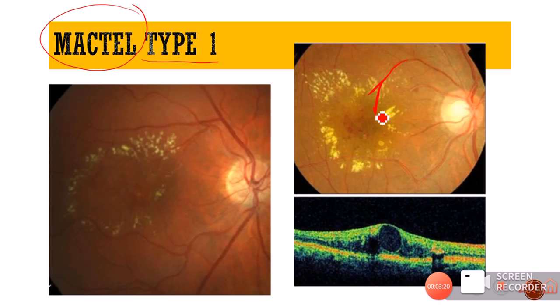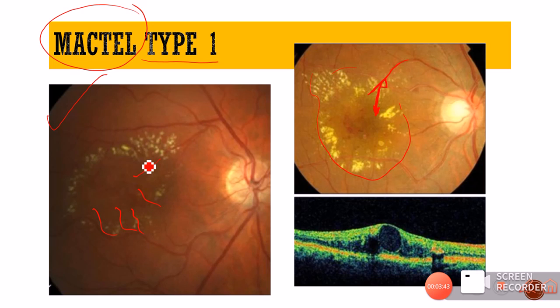If you see a capillary bending at a right angle straight into the macula, that indicates MacTel with surrounding exudation in a ring pattern. In another image, vessels are going into the avascular zone, with the right-angled vessel toward the macula and a grayish discoloration of the macular area — an important diagnostic feature of MacTel type 1 associated with circinate hard exudate.